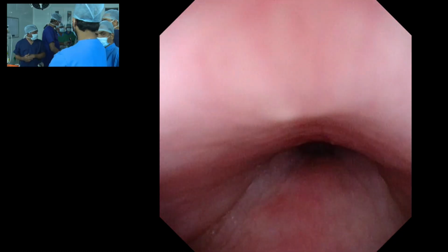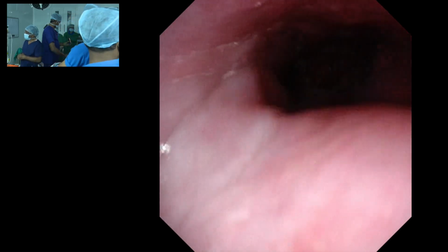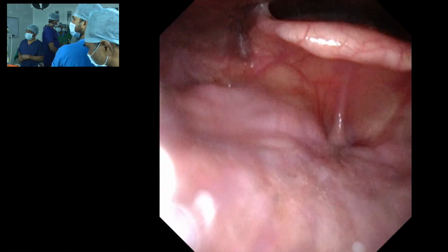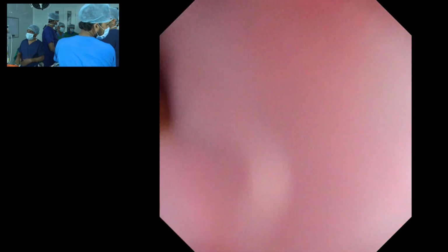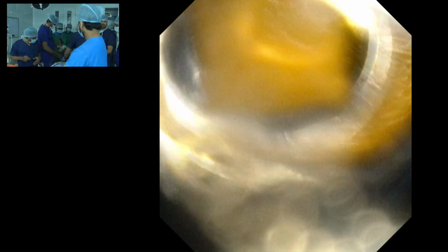Prominent lateral pharyngeal bands on either side, and you can see almost a circumferential narrowing with the vibration of the palate and part of the soft palate. Interestingly, the median glossoepiglottic fold is a little shortened. That means this patient has epiglottic collapse, secondary epiglottic collapse.